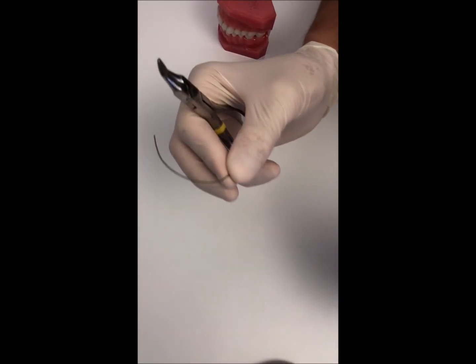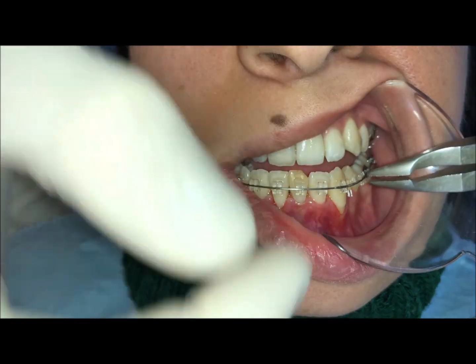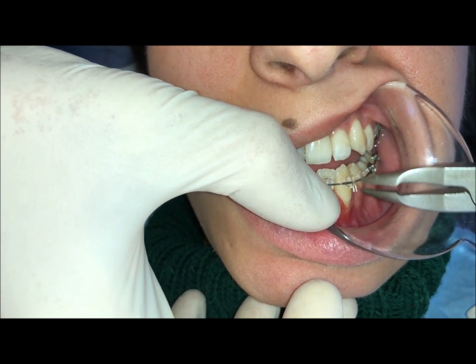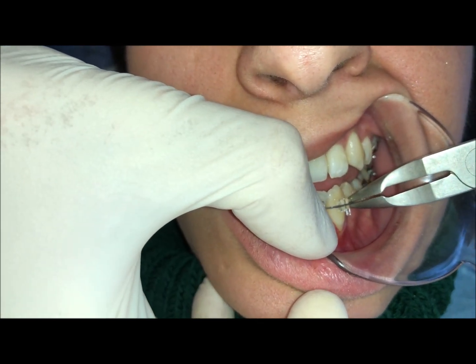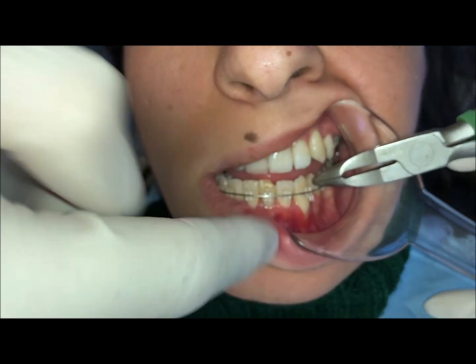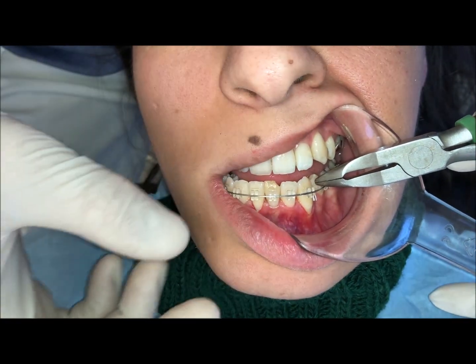Now we go in the mouth. We want to place the root of this canine more lingually, more in the bone. We provided positive torque to this root, around 45 degrees. With the Vanguard, I go inside the bracket and leave it. Then it is possible to tie the bracket and provide in this way the positive torque on the lower left canine. The torque is activated now on the wire.